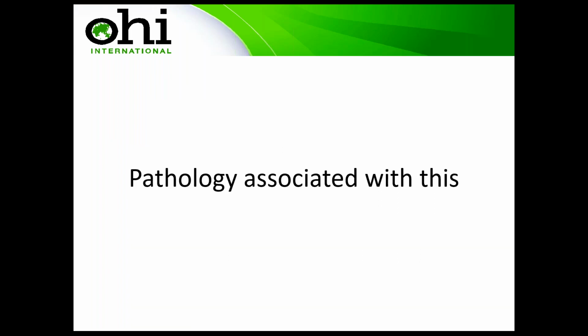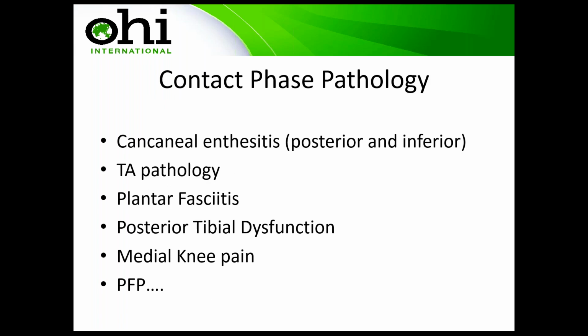What are the pathologies associated with contact phase? When we look at the heel and we see the flag for really fast loading, or for the knee loading very quickly, what we're going to see all the time are the same injuries over and over. There are some weird and wonderful ones, but as a podiatrist treating patients for 20 plus years, you see a lot of calcaneal enthesitis. You get a lot of referrals for plantar fasciitis, but it's actually the insertion of the plantar fascia into the calcaneum that causes all the problems.